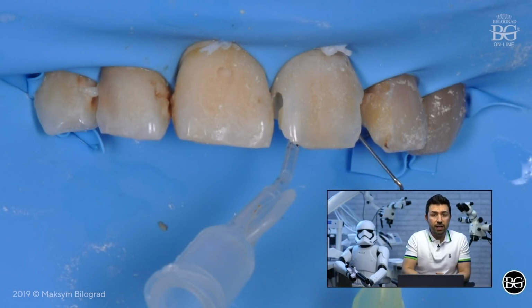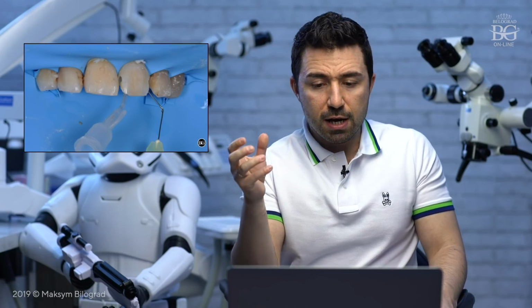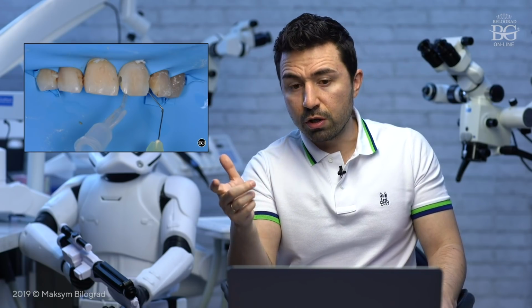Another trick and tip that I would like to share with you is how to irrigate when you have an open apex. In this case, the apex was pretty huge, and there is always a risk during the irrigation process that some amount of sodium hypochlorite, if you use sodium hypochlorite for irrigation as the gold standard, can be extruded through the root canal into the periodontium. So there will be a high risk of some toxic effect of sodium hypochlorite and some inflammation after its extrusion.